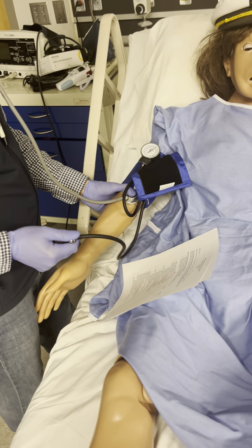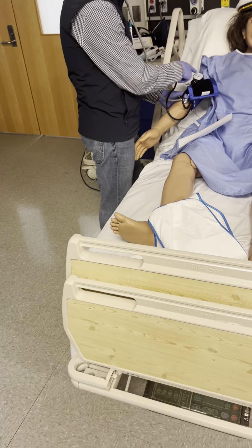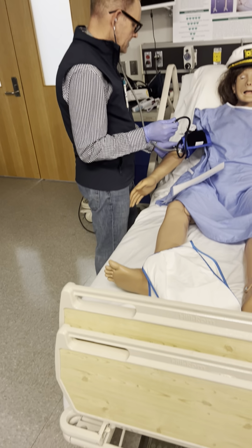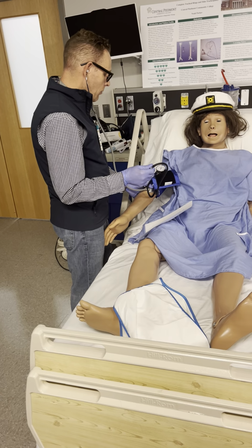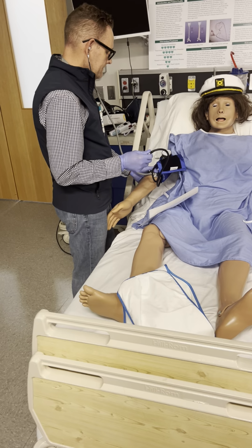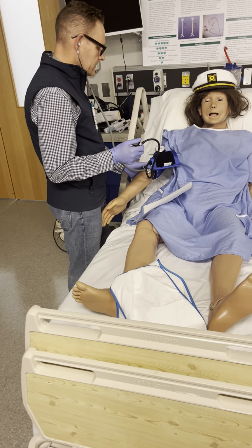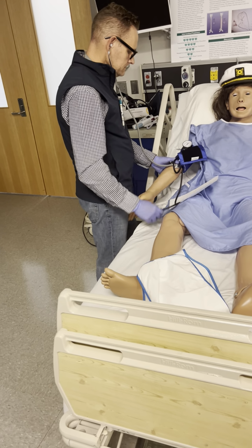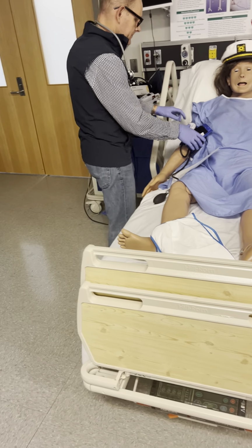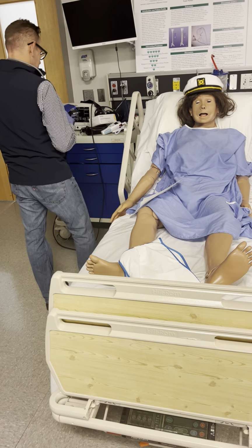We're at 180. I'm gonna slowly release, and I'm gonna listen, and I'm gonna see when my little hand starts jumping. As I slowly release it, at 140 I can hear something. And at 60 it fades away. So 140 over 60. Okay, got that. So my blood pressure is 140 over 60. Put that away.